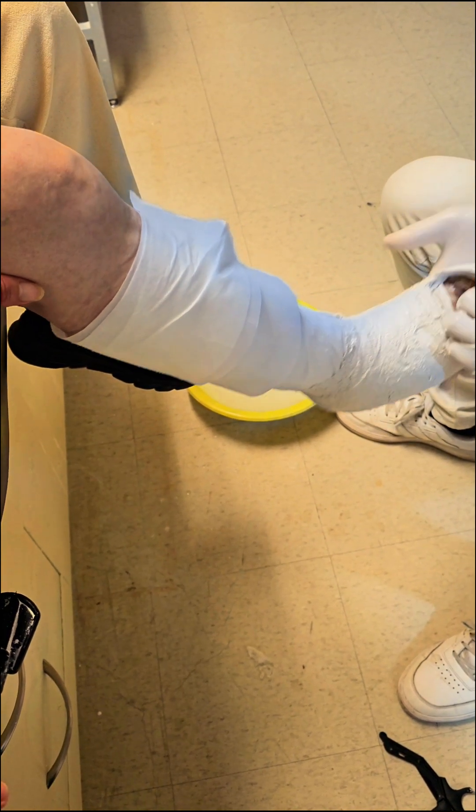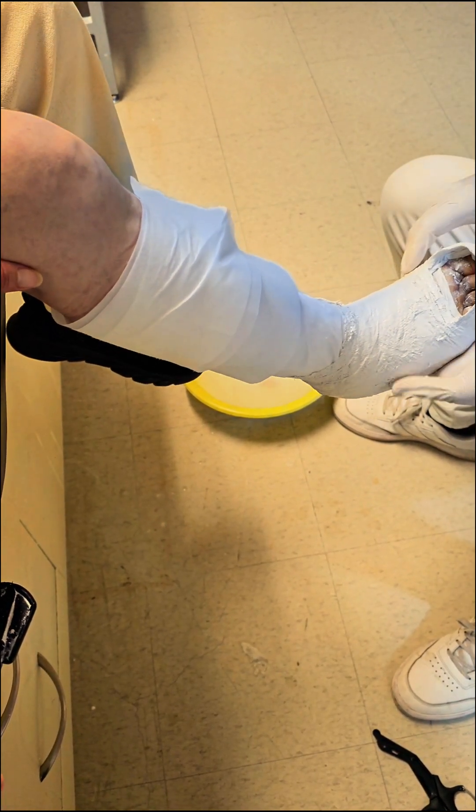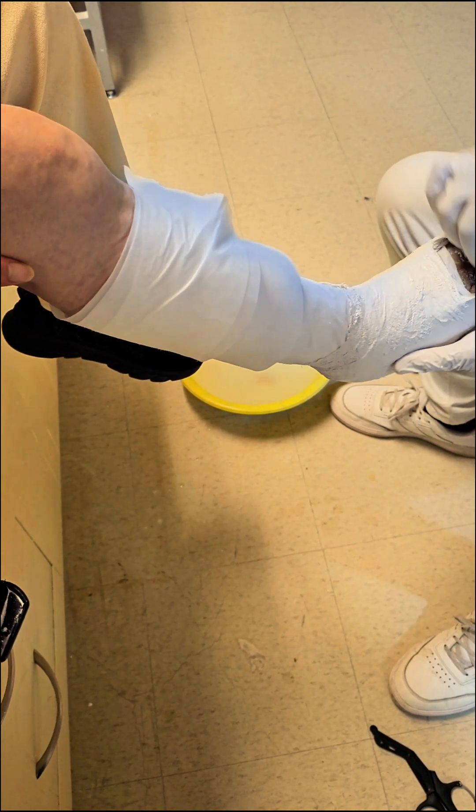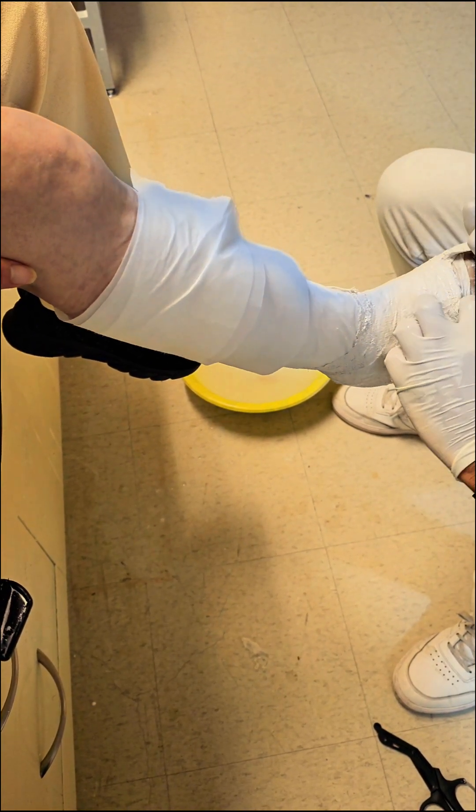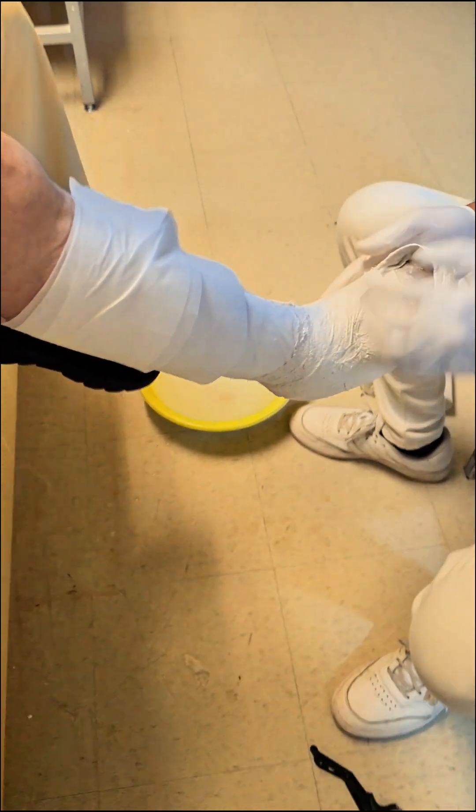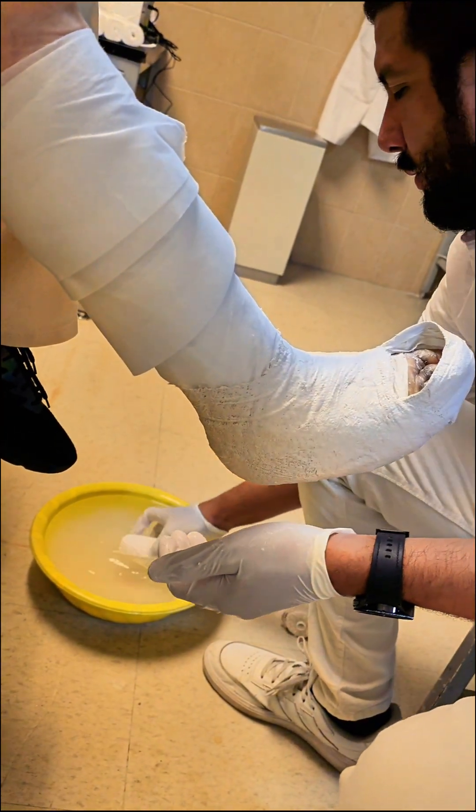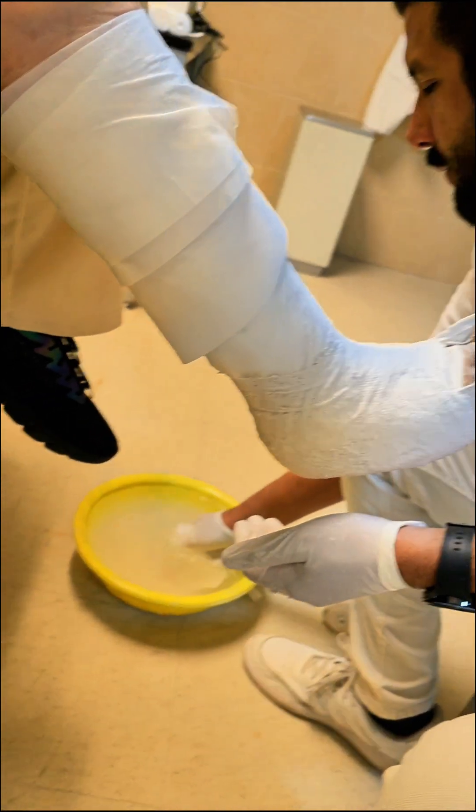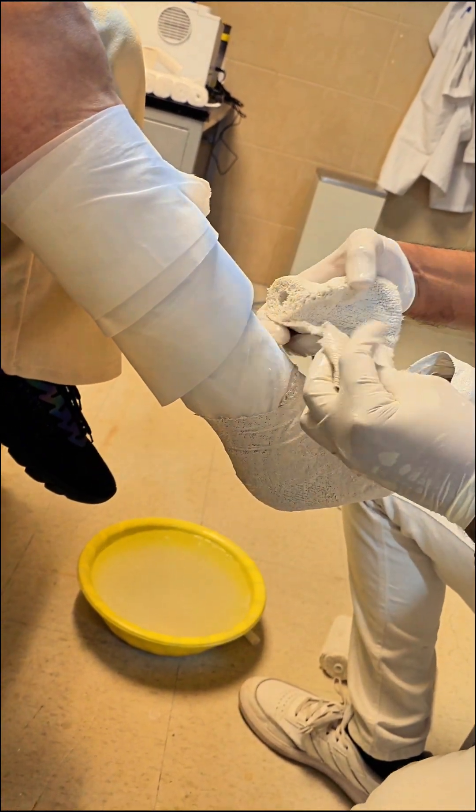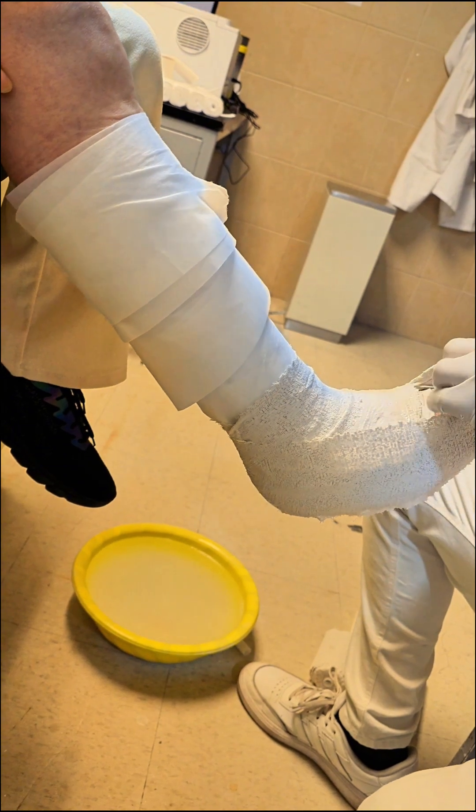Three: casting material. Using fiberglass or plaster, begin wrapping the material from the toes up to the mid-calf. The key is to ensure even coverage and avoid any tight spots that could restrict circulation. Four: molding. As the material begins to set, gently mold it to the contours of the foot, ensuring it provides support without being too tight. Pay special attention to the arch and metatarsals.